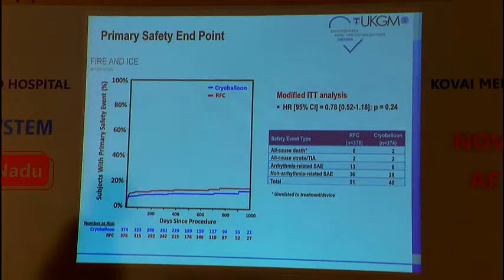What about the safety endpoint? And this is something your patients will ask. What about stroke after the procedure? We are performing ablation within the left atrium. There's a connection to the head. Stroke risk intraprocedurally, very low. Of course, there's a risk for groin hematoma, of course. What about all-cause death? All these complications, very, very low.